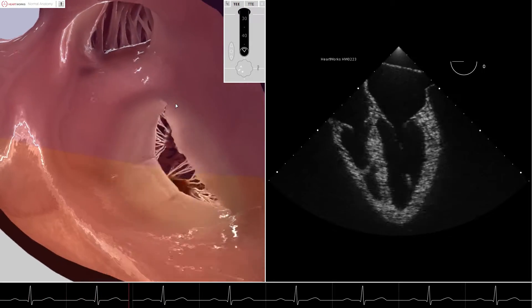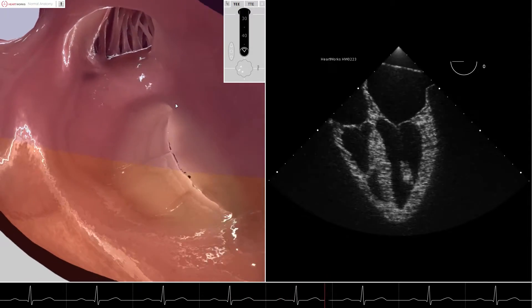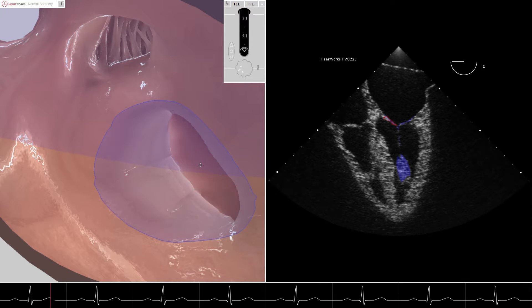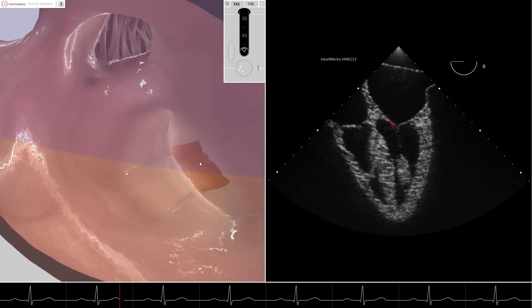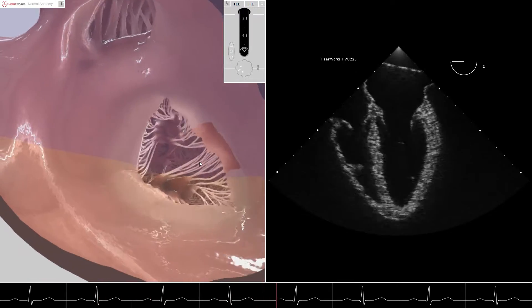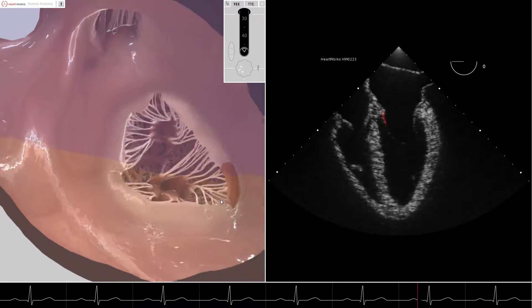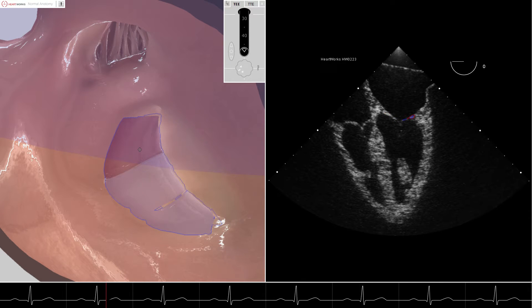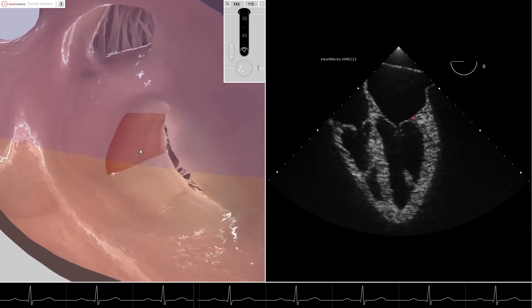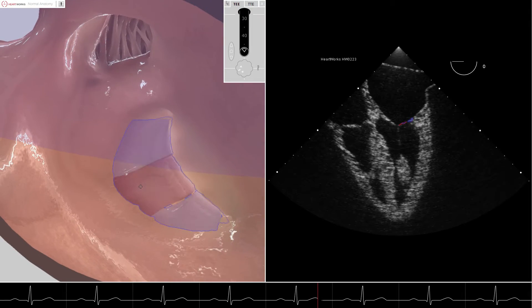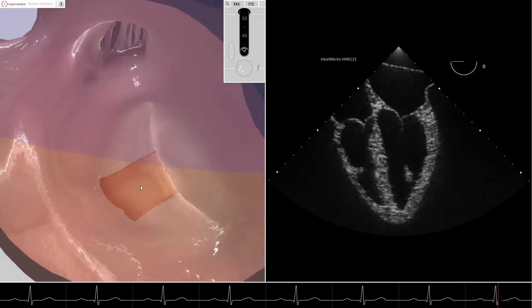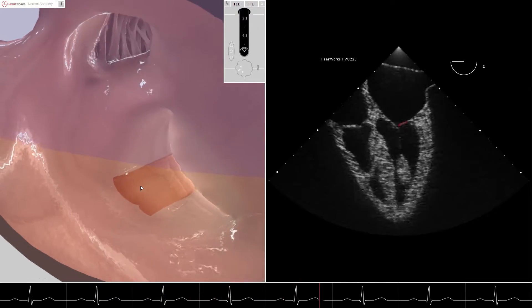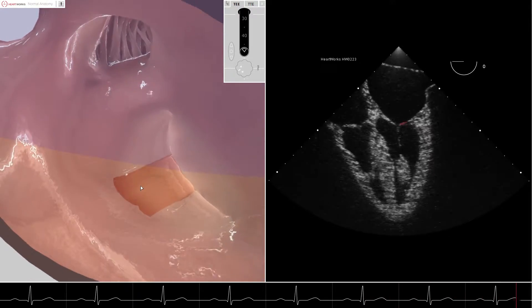We have returned to the cut plane at 0 degrees omniplane in the mid-esophageal 4-chamber view. In this case, the cut plane transects the A2 and A3 scallops, the P1 scallop, and the P2 scallop. It should be noted that minor variations in probe and omniplane position can result in various combinations of scallop transection. However, the anterior mitral valve leaflet and the posterior mitral valve leaflet will always be transected at some location.